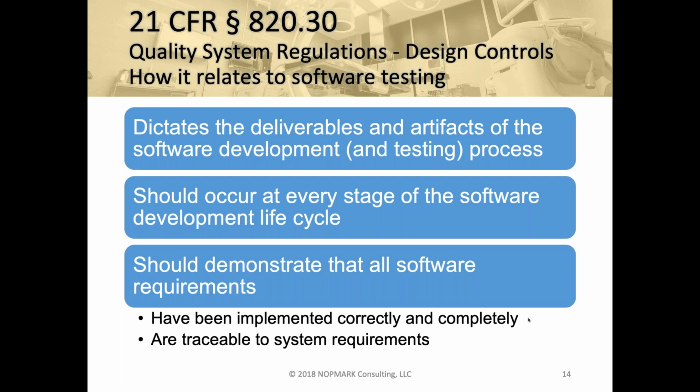So I emphasize the word all because in some industries your software requirements may be a backlog of user stories, or you may have software requirements with different priorities, and you may choose to test based on the priority of those software requirements. Some of that flexibility goes away when you're in the medical device field, which is if the project is scoped to deliver X number of software requirements, there has to be complete coverage of all of those software requirements.